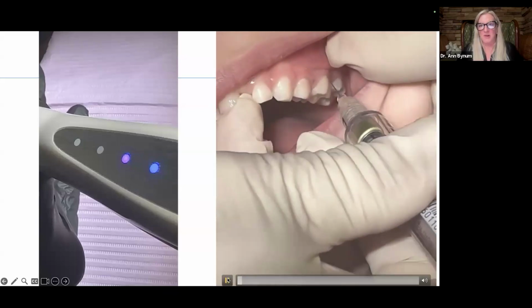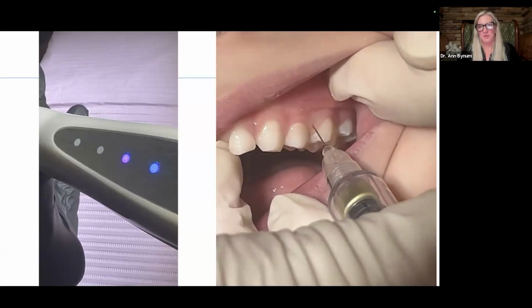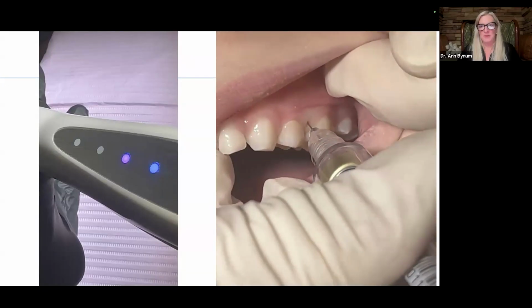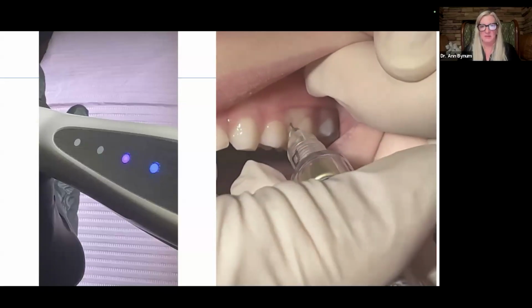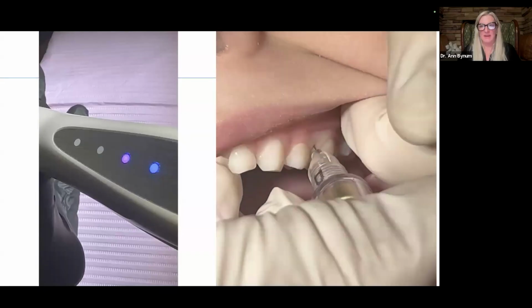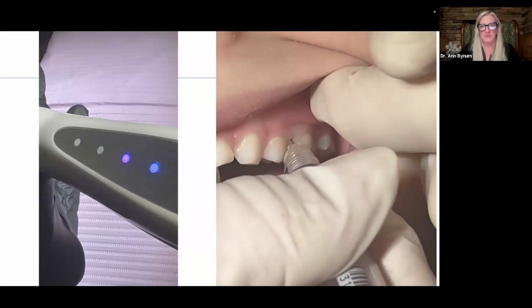Here's another example in our office for stage 2, going in, positive pressure with bone. Then we lean on it a little bit more. Then we tug back a little bit, make sure we're in. We weren't in, so we're going to twist. Twist some more, tug back. We like it now. We're ready to go. Step on the pedal and start to deliver.